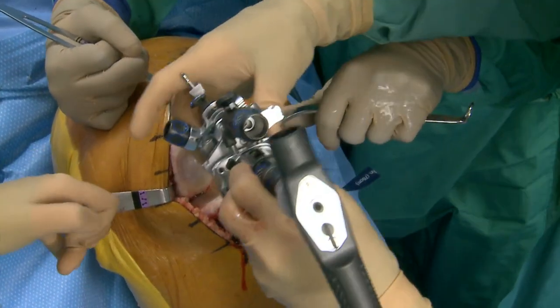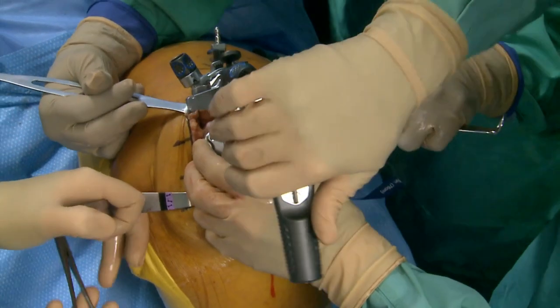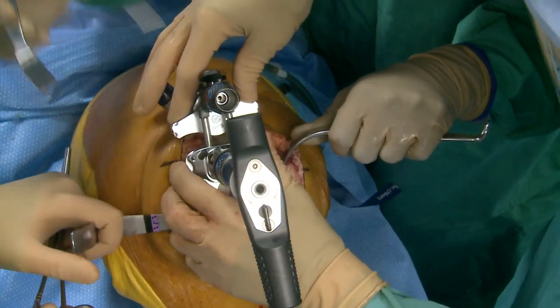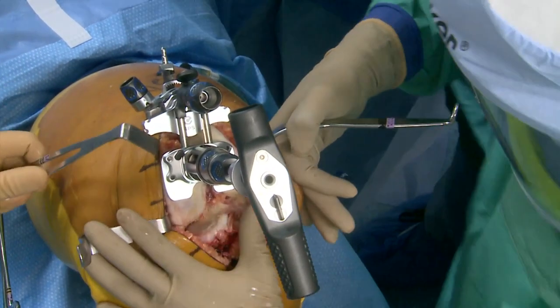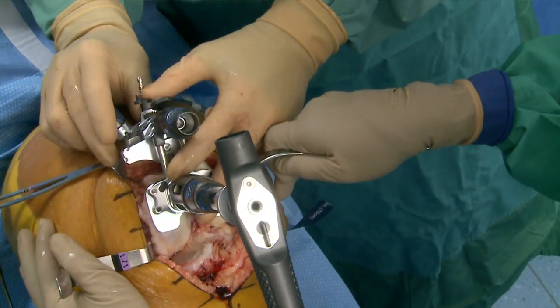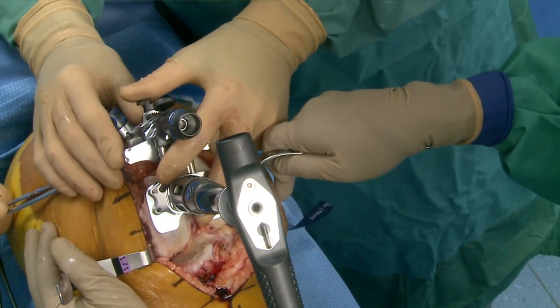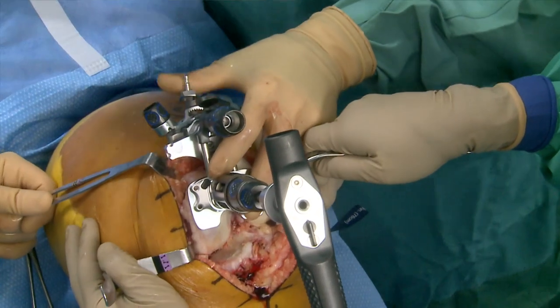Since I'm PS, I'm cutting the PCL, so I'm going to open the flexion gap a little bit and take just a little bit more off the distal femur to compensate. The implant is eight millimeters distally. On average we talk about opening the flexion gap about two millimeters when we cut the PCL, and everybody gets five degrees of valgus — all comers, varus and valgus knees — everybody gets five degrees.